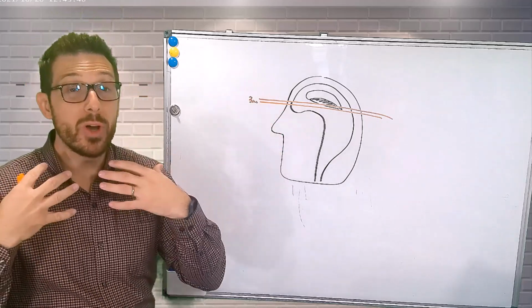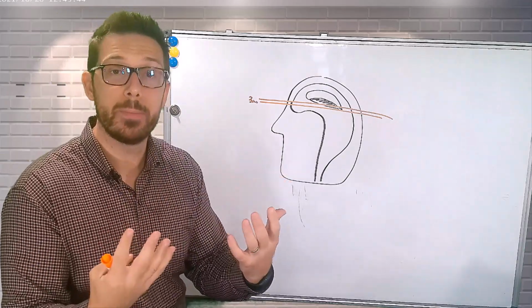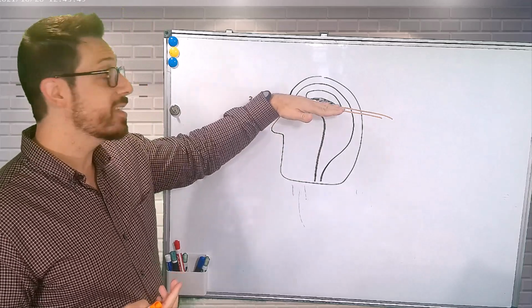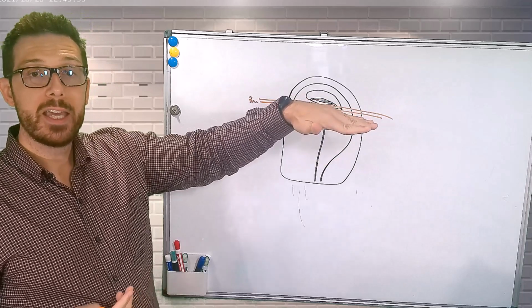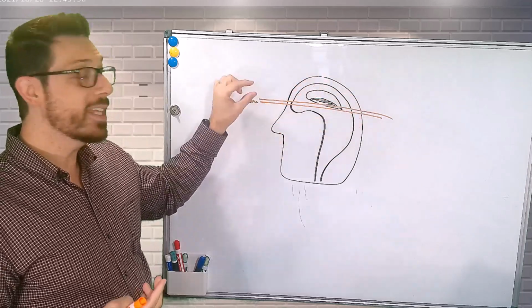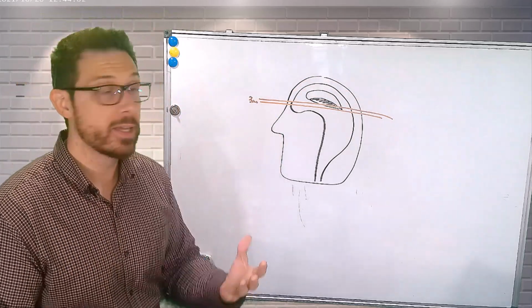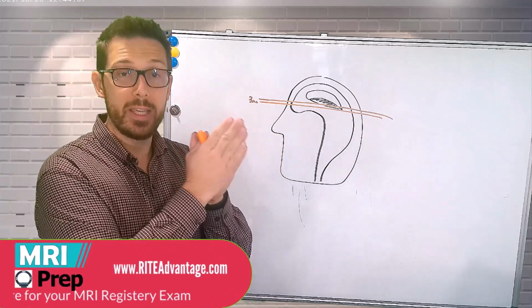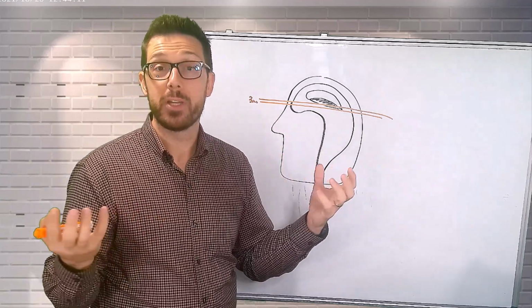When I look at my image on my screen, I'm seeing a two-dimensional image. Anything that I acquire from a data standpoint in millimeters, I essentially pull out of my patient. In this example, I've got an axial slice. It's pulled out of my patient and I look at it. But it's a two-dimensional image on my screen, which means that 3 millimeters of tissue have been averaged together into one image. So 3 millimeters might not be that bad of an image. It might actually look pretty good.